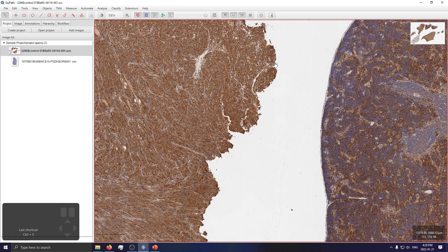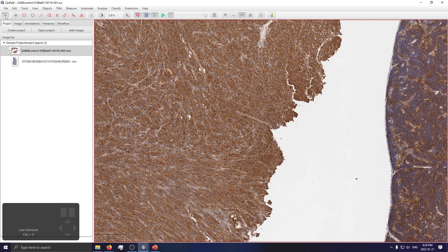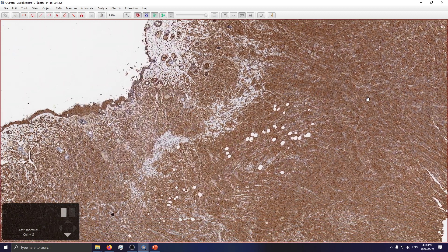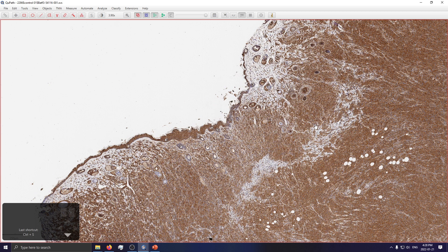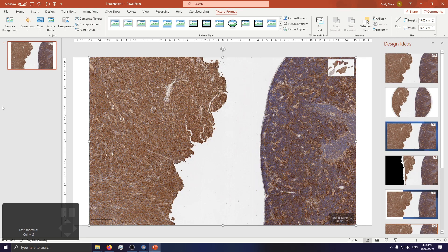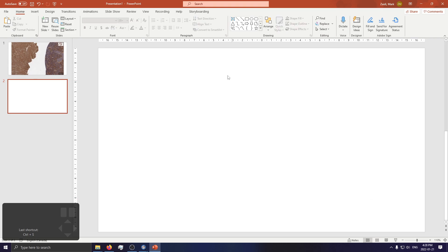Now let's spruce up our images a little bit. We don't want to see the thumbnail — click this button and it'll hide it. We want to clean up the bottom right display — uncheck that. Maybe we want more real estate on our screen — we can close the analysis pane. Now we have a nice clean view for quickly viewing the areas. Zoom in as much as you want.